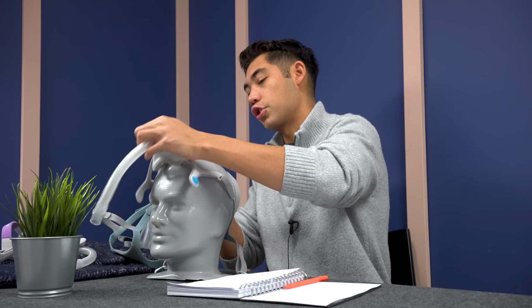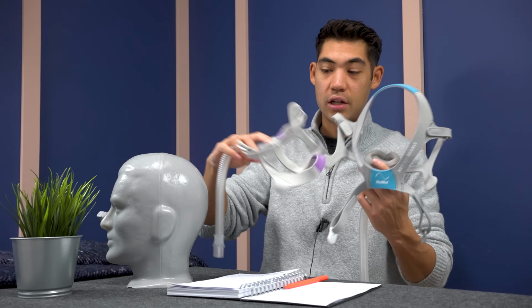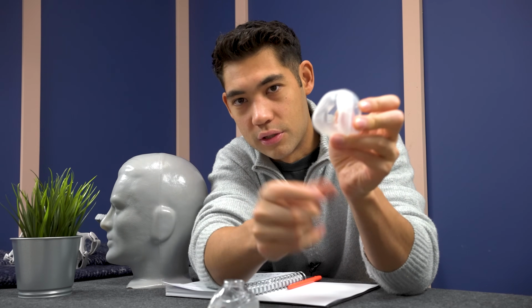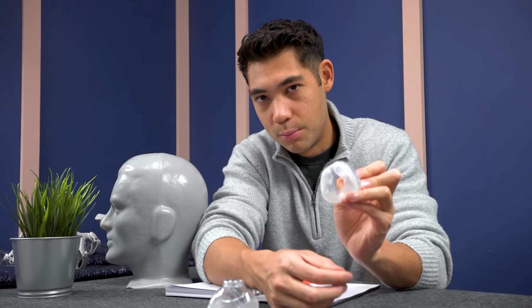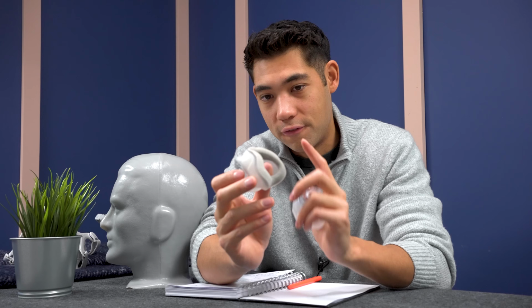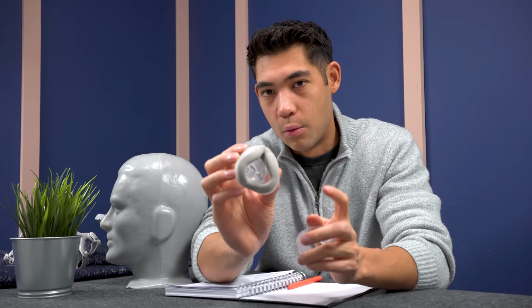Taking this off, I just want to show you the difference between an Air Fit and an Air Touch. So an Air Touch cushion has kind of a memory foam type of padding around it, whereas the Air Fit has the traditional, more silicone. The Air Fit is a lot easier to wash and clean. You can keep it for a longer period of time, but the Air Touch for a lot of people definitely holds a seal better, especially those with facial hair. So if you're having a problem with leak, you might want to try an Air Touch.